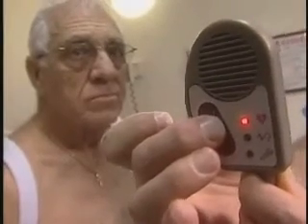Treatment stopped by response button. Bystanders, do not touch device.